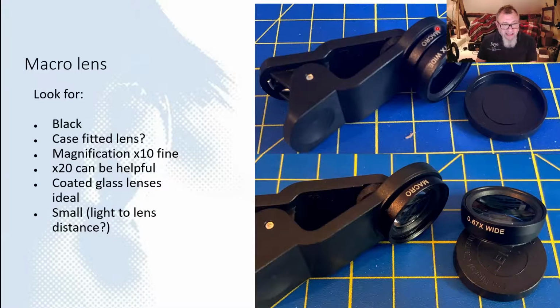To do this, you need to have a macro lens. These are cheap and readily available. They often sell them at the garage.